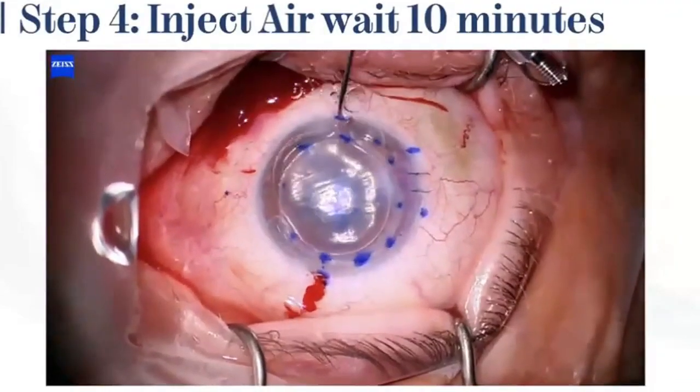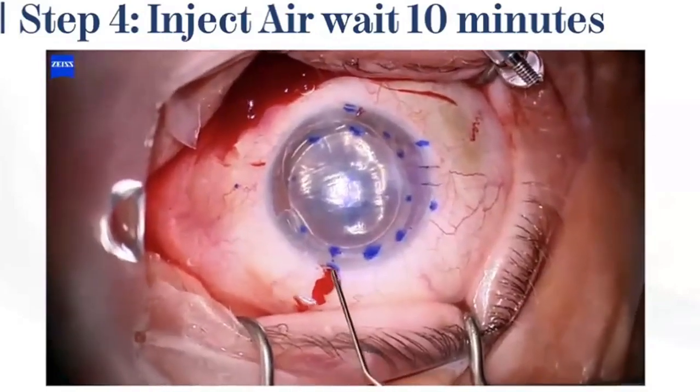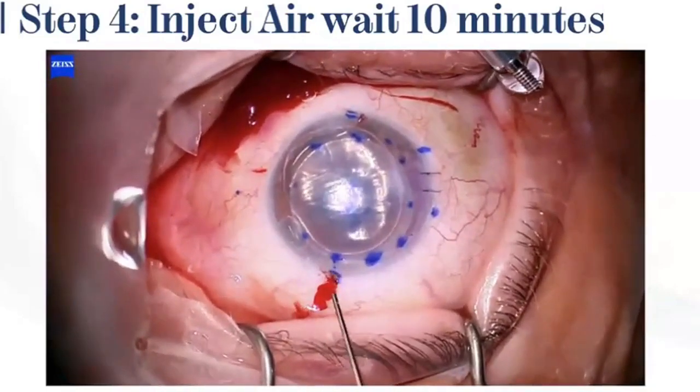After the graft is positioned carefully, using a variety of brushing and sweeping techniques, we inject air and we wait 10 minutes in the OR. After that, we check again to see the percentage of our bubble, and whether we need to put in more air or if it's okay. Then we can send the patient to lie supine for 1 hour to see them again.